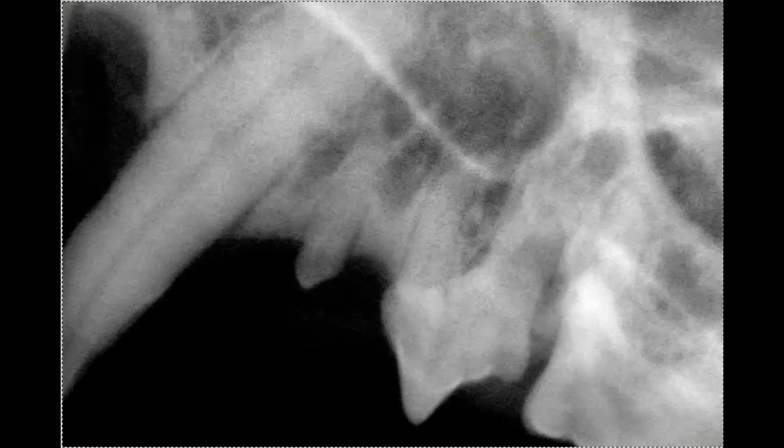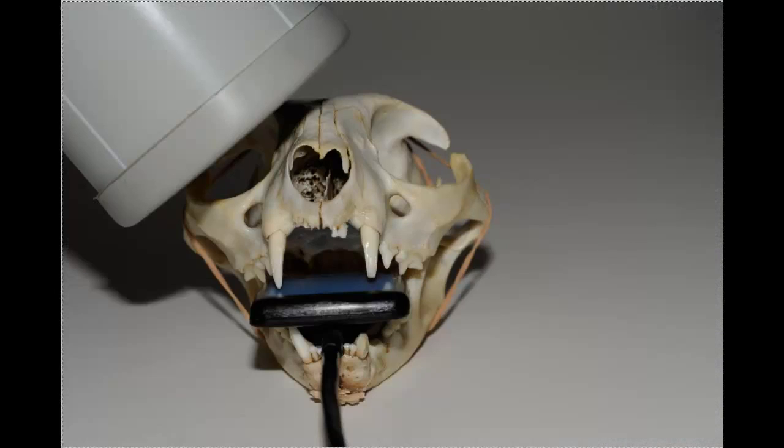And this might be something that we would see as a result of that. The easy part about this technique is the sensor doesn't have to move. It remains in the mouth. We simply go to the other side.